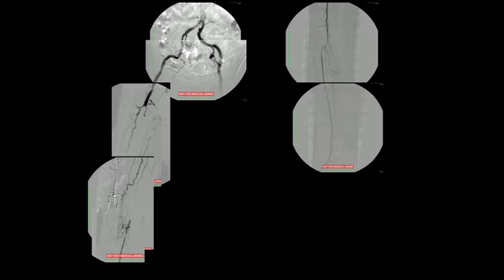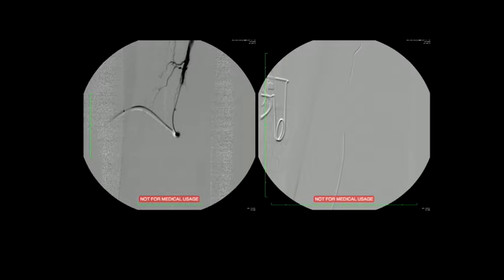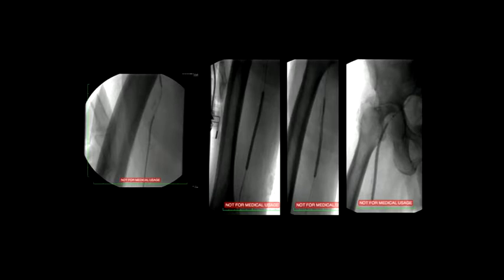So after the initial, not to waste too much time with this, I'm sorry, it's gone off. A totally clean artery at the end of the atherectomy. This is not a very common opening up, removing the plaque, but it tends to get the ulcer or the wound to heal. It provides you that much needed time when the wound, you're okay. So atherectomy may help in cases where standard angioplasty fails. If you want a large lumen, actually in places where you never want to put a stent.